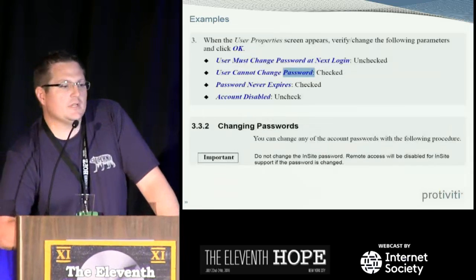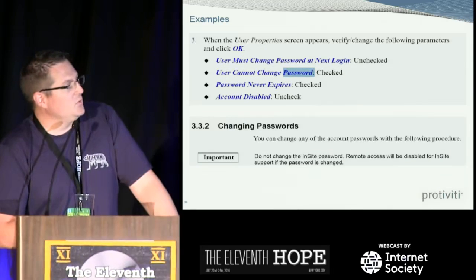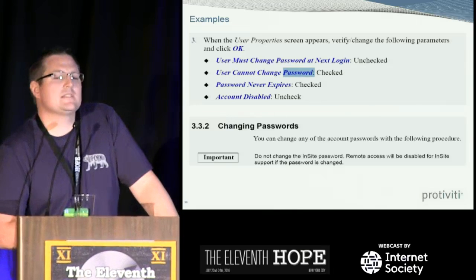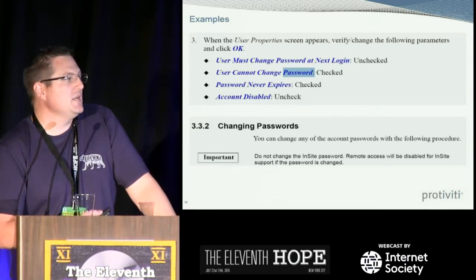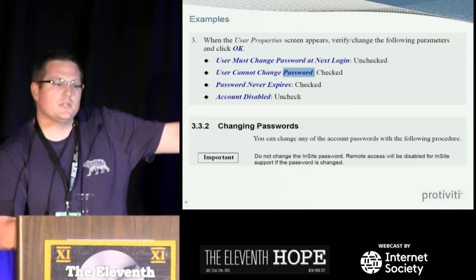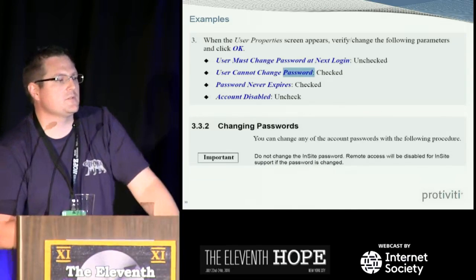So if you wanted a customer to change a default password and you wanted to ensure they would change that password, would you tell them to check user can never change password? Would you tell them to check password never expires? That's not indicative of a default credential. And so these credentials, whether they're truly hard-coded on the back end, which in some cases they definitely are, or they just are told in the instructions like this, important, do not change the password or we will not support you. What hospital organization is not going to listen to that, especially when we put it in big and bold and say, don't do it or we're not going to be able to support that system.